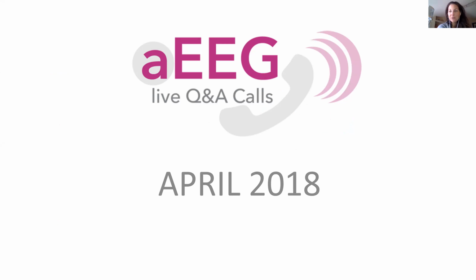So anyways, feel free to unmute yourself if you have any specific questions, but this is our monthly Q&A call related to amplitude integrated EEG. And today we're going to talk a little bit about aEEG and cooling.